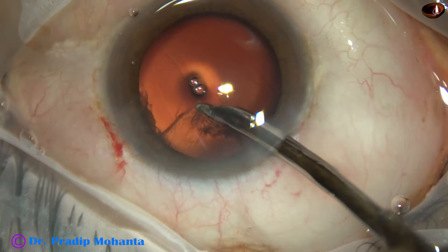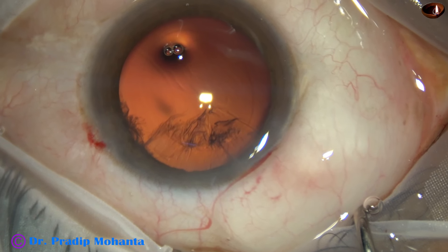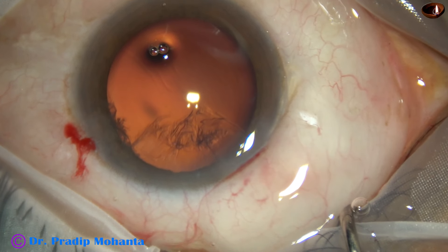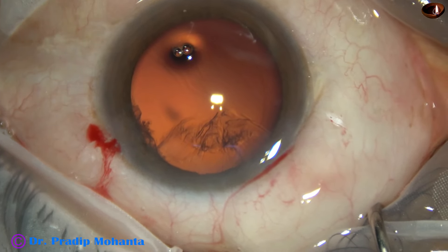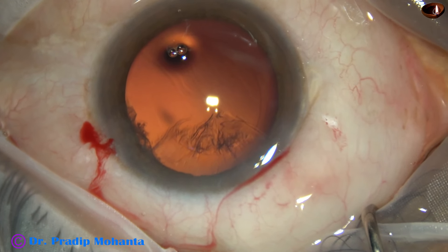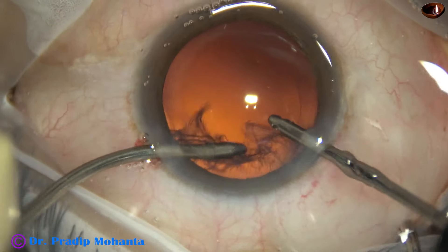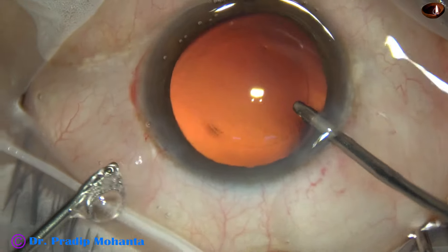This is the last portion of the cortex. I find that it is not coming easily. By this time there is some chemosis, so I just make a small nick in the fold of conjunctiva. Now somehow I have to remove this cortex, so I am using bimanual irrigation-aspiration. Irrigation goes through the main wound, aspiration through the side port, and it gets over.